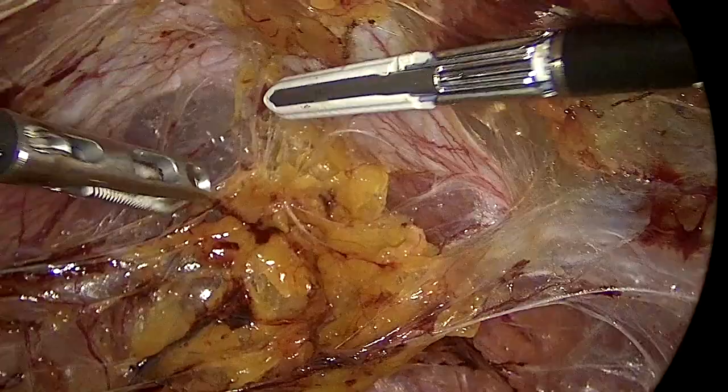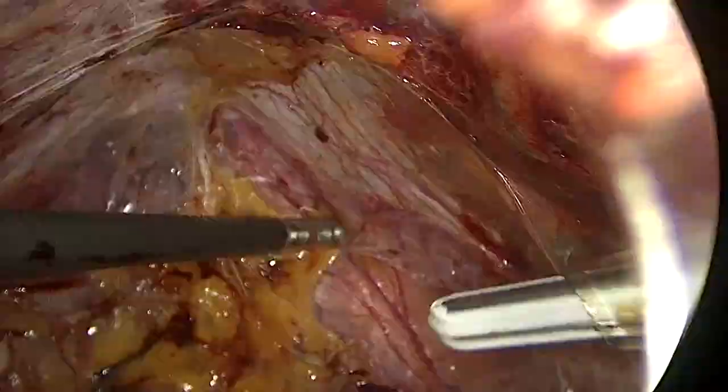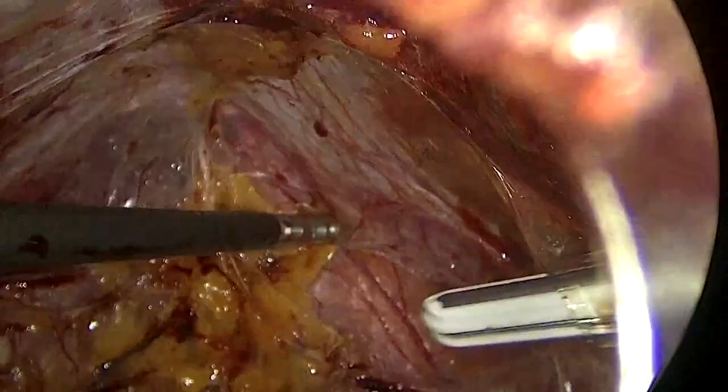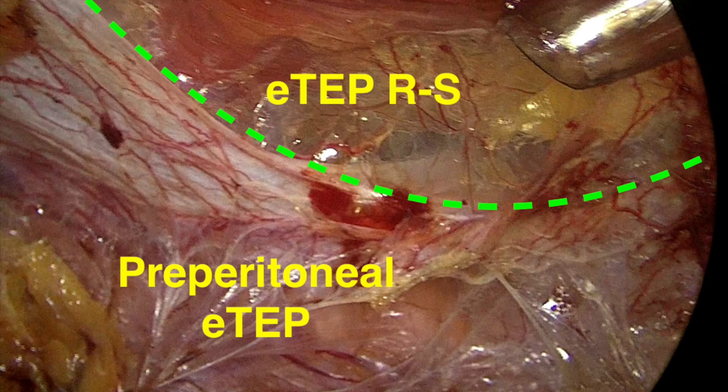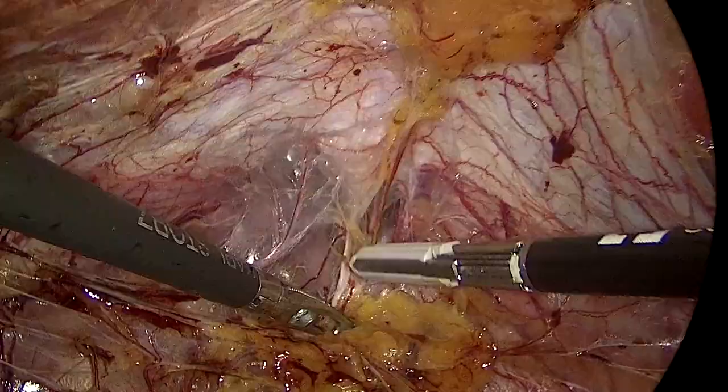Here you're going to see a very nice demonstration of the planes of dissection. You see the posterior rectus sheath, the arcuate line, the area where you would go if you want to do a typical Rives-Stoppa, and the area where one goes when doing preperitoneal ETEP.